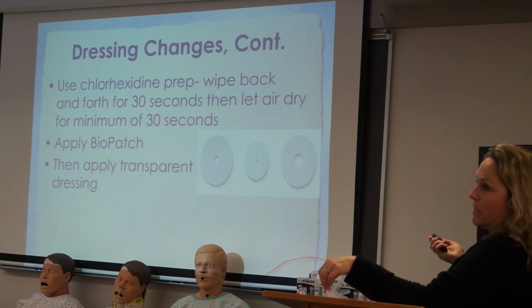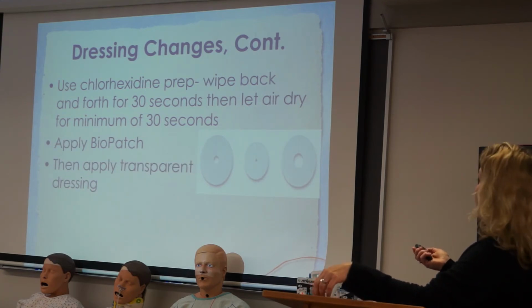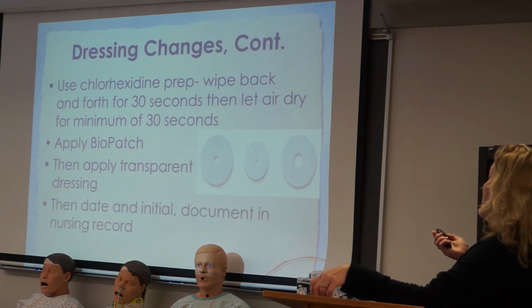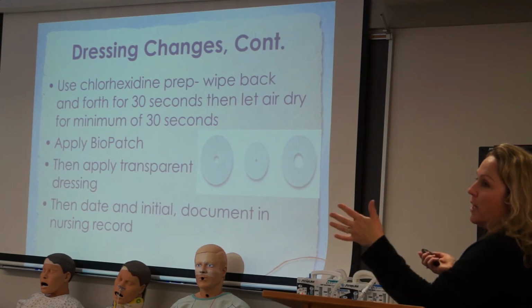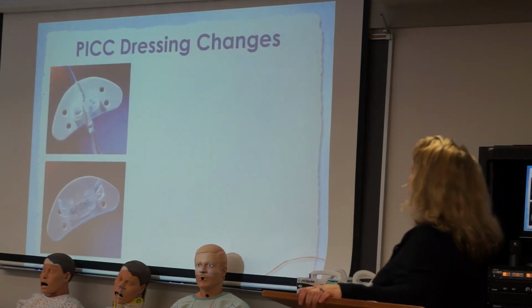What is that called, the transparent dressing? A Tegaderm. And then you always want to date, time, and initial, and then document that you did the dressing change, because if you don't chart it, it wasn't done.